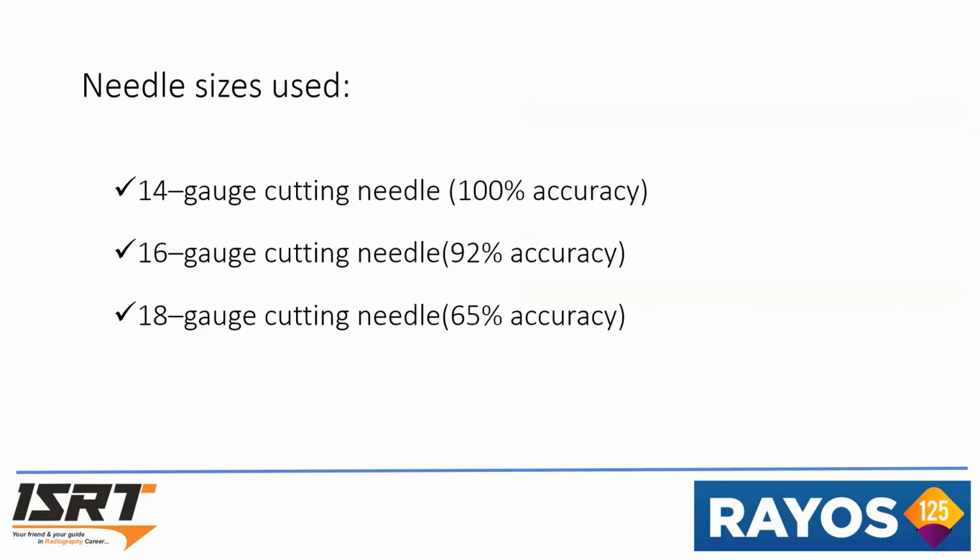The needle sizes used for biopsy are a 14 gauge cutting needle, a 16 gauge needle and an 18 gauge needle, in which the 14 gauge needle has more accuracy.